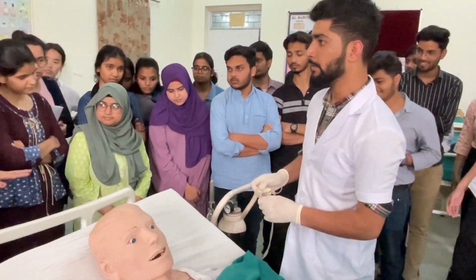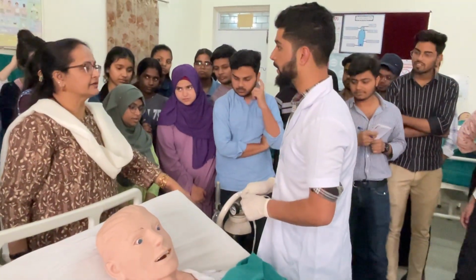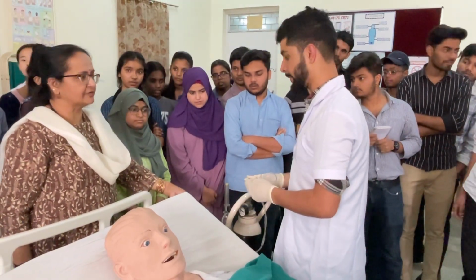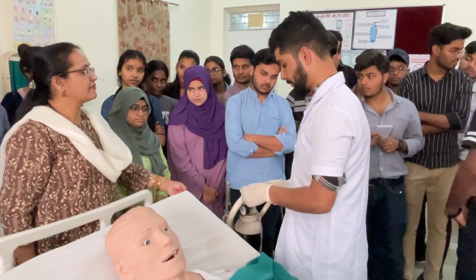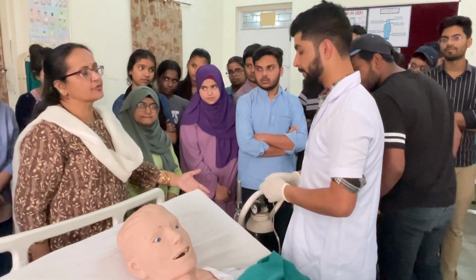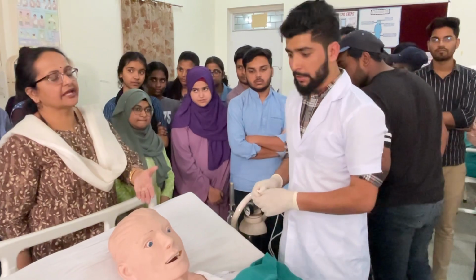He has filled water in the humidifier. Is it required to fill the humidifier with water? Which type of water do we have to fill? Distilled water. Why is water filled in this humidifier? How is it going to help the patient?